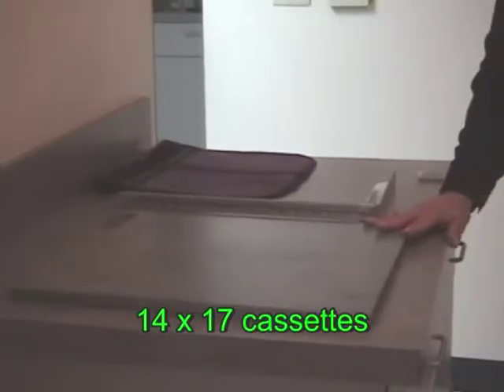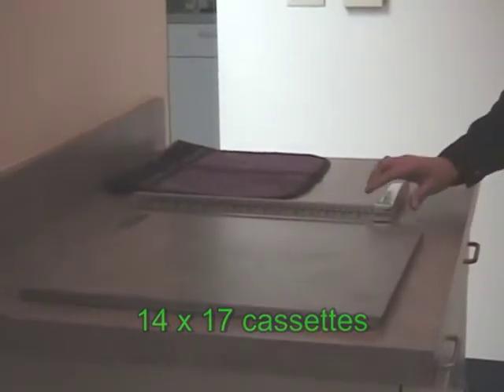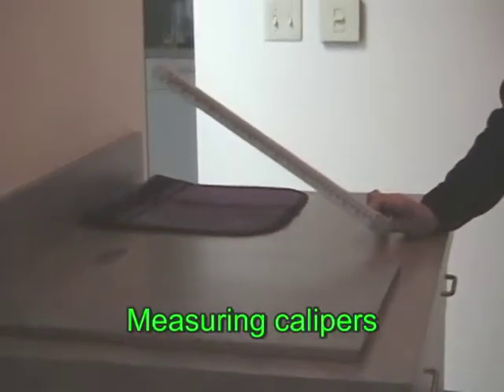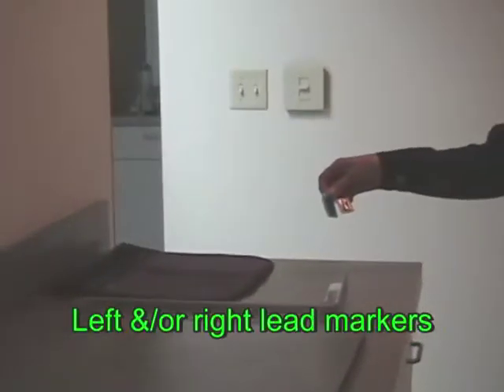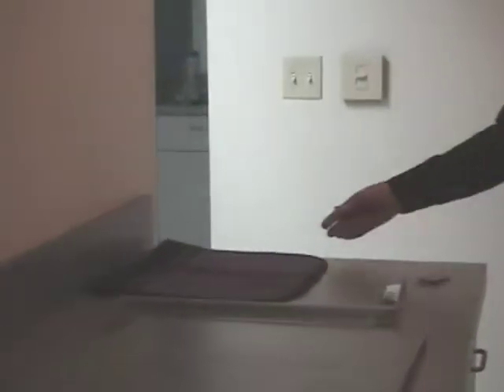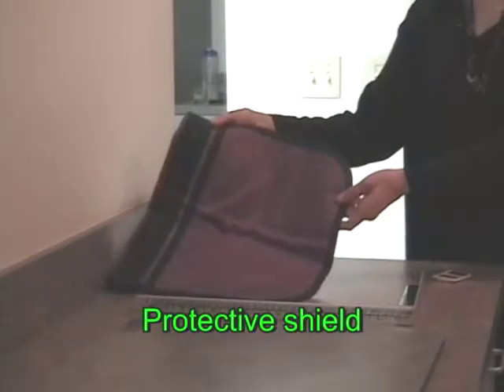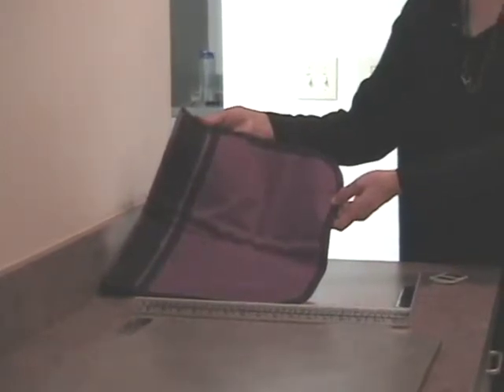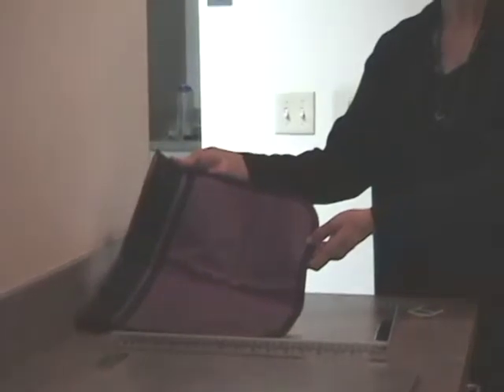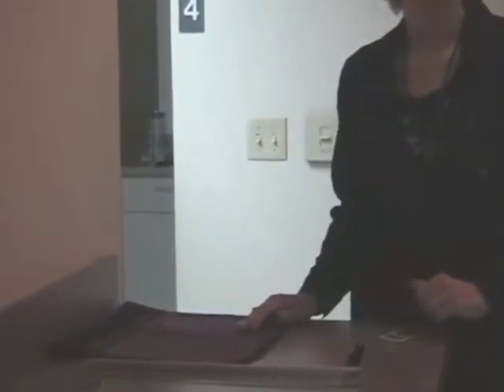I've put some supplies out into our room that I would like you to look at now in getting ready for a chest x-ray. You will need 14 by 17 cassettes. You will need measuring calipers. You will need left and or right lead markers. And you will need a protective shield. This happens to be an apron. You might need to use a strip of lead to protect the reproductive organs. Having supplies readily available is a must.